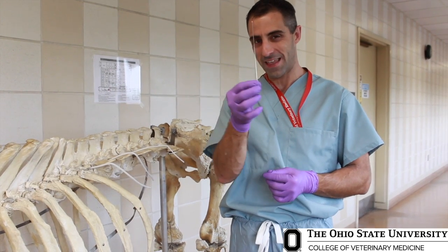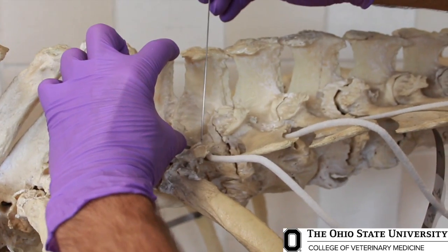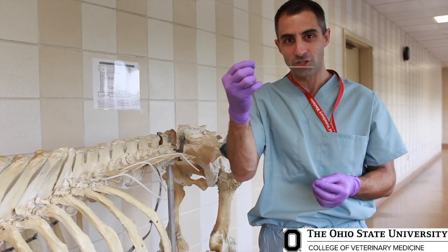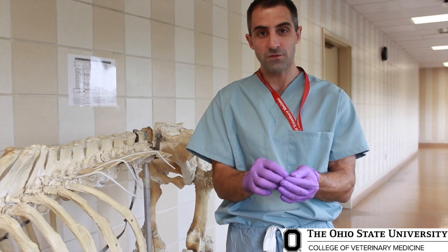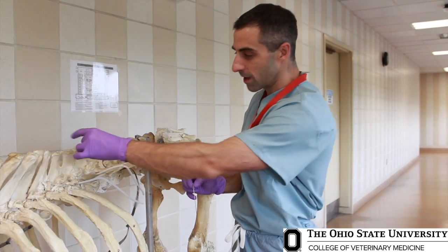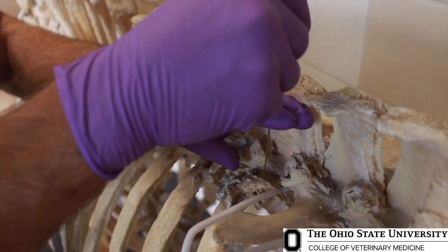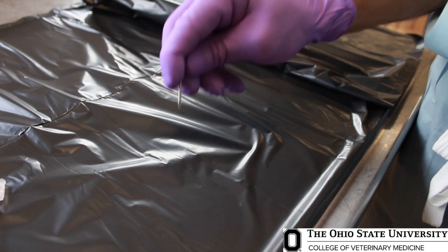We need to use a 6-inch 18-gauge needle because we need to get down probably at least three or four inches before we actually reach the level of the nerve. Since this is an 18-gauge and such a long needle, it's pretty flimsy. If we try to get this through thick cowhide, it's likely going to bend. So we're going to use a 14-gauge 1-inch needle as a cannula just to get through the thick skin. Once this is through the skin, the 18-gauge needle will go through the cannula and we'll go down to find the bone associated with the nerve we're trying to block.